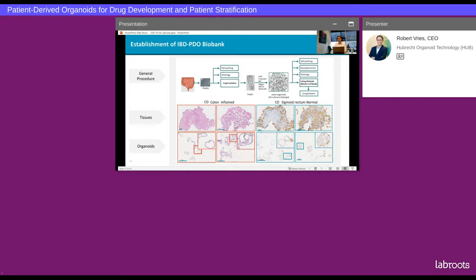Of course, as we know, some of this is lost in time, because when the inflammation goes in a culture system, also a part of that inflammatory signature goes. However, other parts of it are more stable, and you will see them long-term in the organoids. So by taking different regions, as said in the beginning, of the intestine, colon and other organs, of course, we can study the specifics of that region. And also, in the case of this inflammatory disease, we can take inflamed region organoids and relatively healthy, uninflamed sections of the intestine, and make organoids of both to do comparisons.